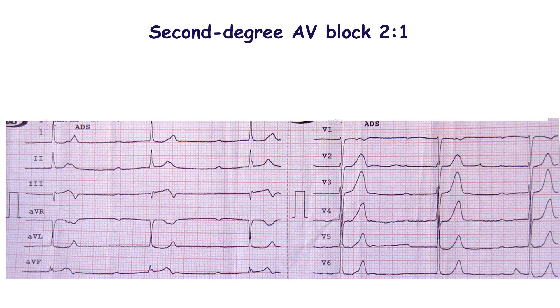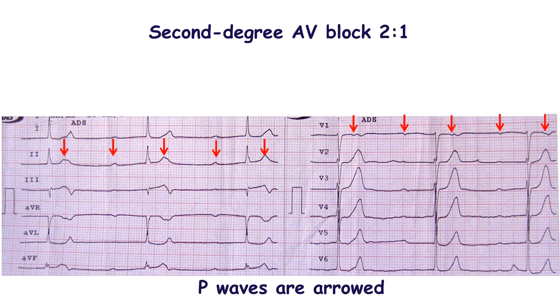The recorded ECG showed second degree AV block with 2-to-1 conduction. At first look, this appears to be first degree AV block on the background of sinus bradycardia. However, there are two P waves before every QRS complex. The first of them merges with the T wave, but in some leads it is obvious.